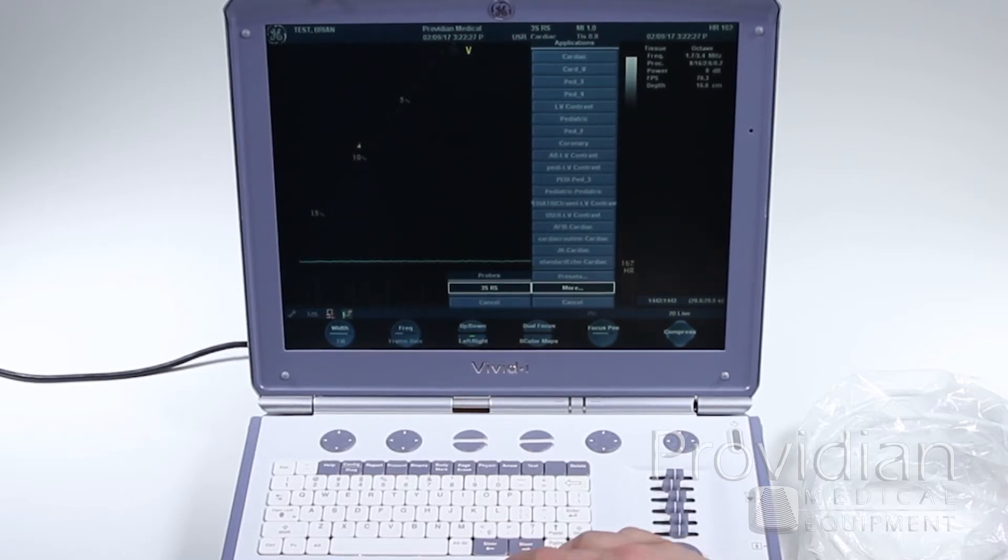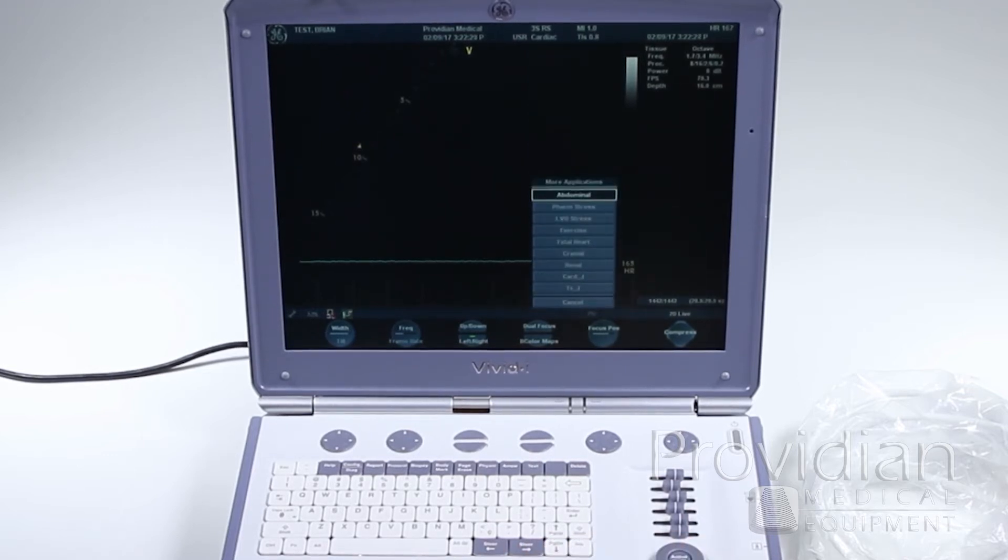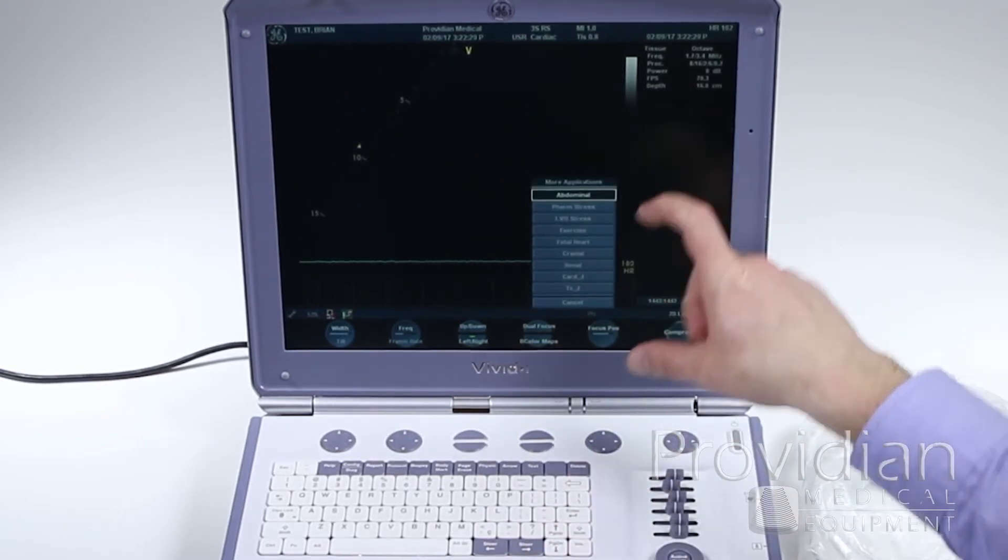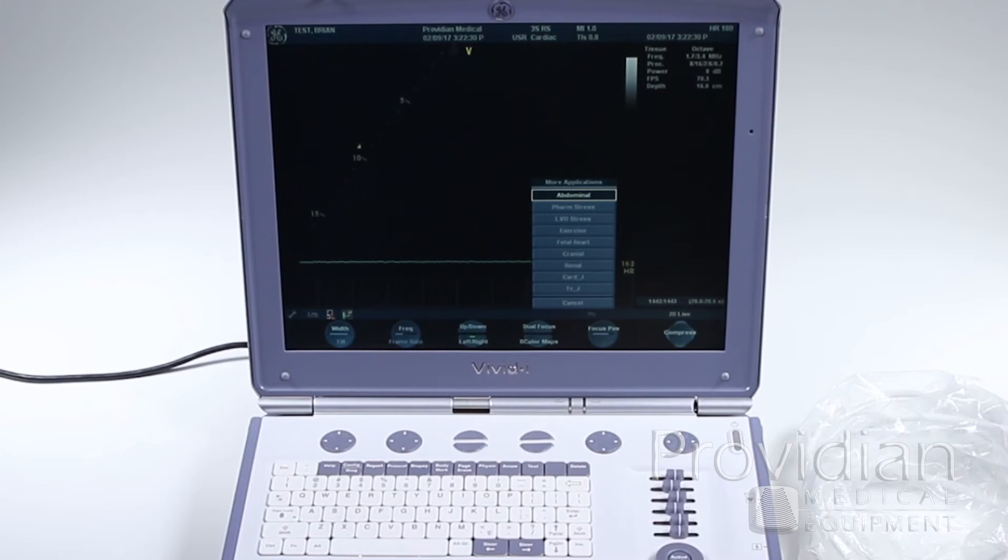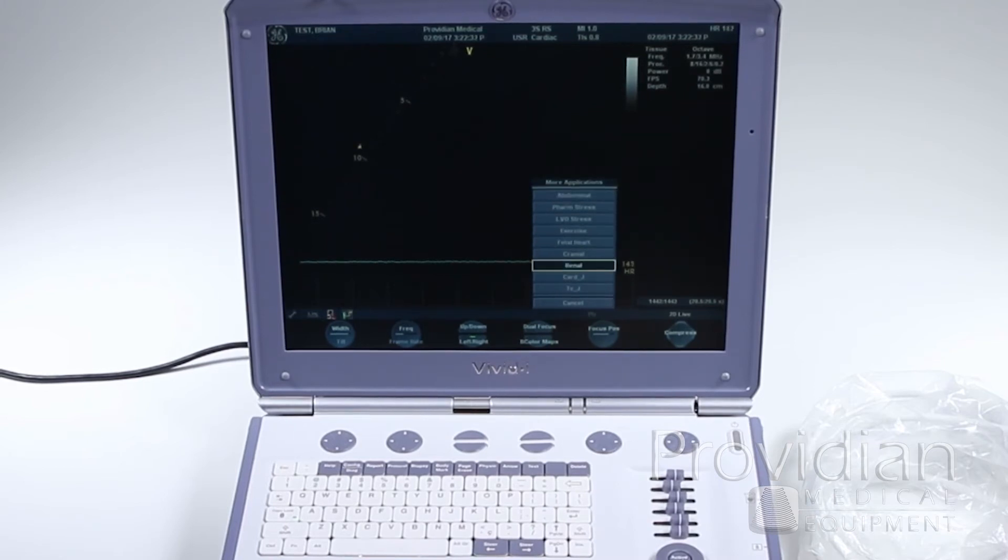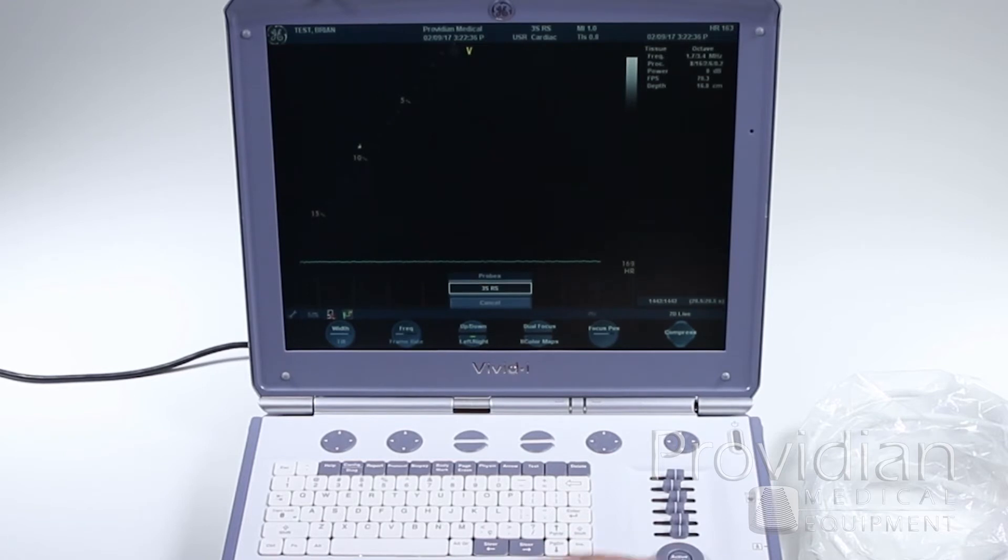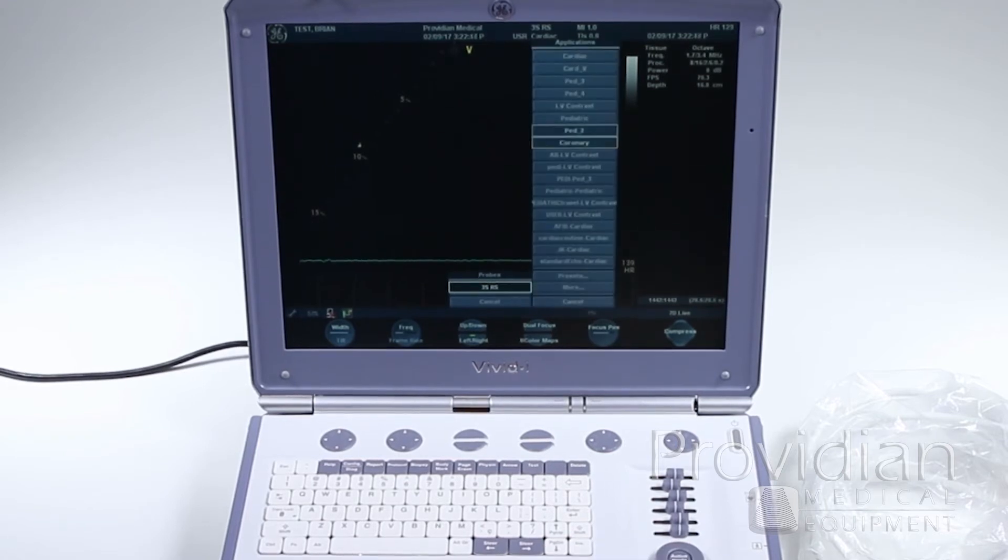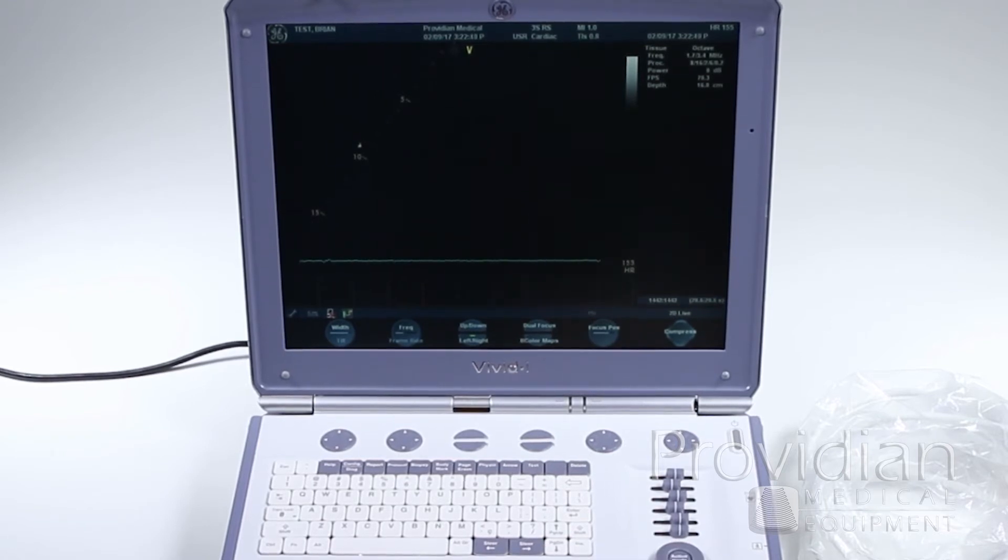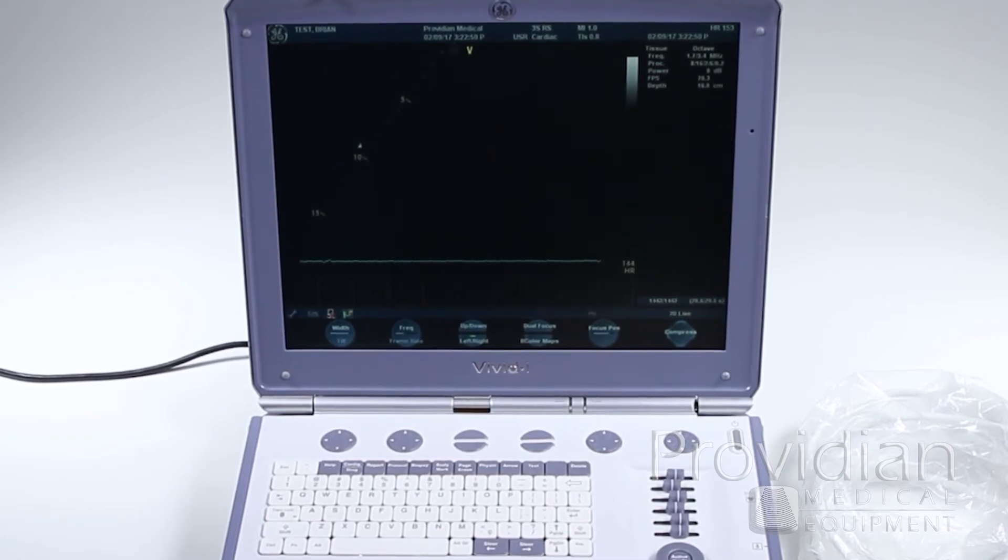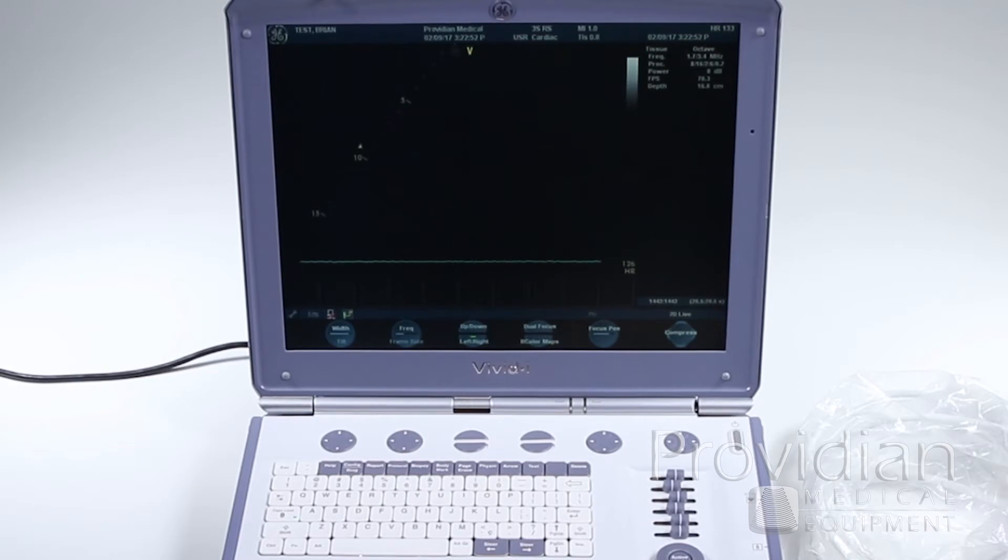But you can also click more, which gives you a whole other set. We have stress, abdominal, fetal heart, etc. So I'm going to hit cancel. I can go to application and then I'm just going to go ahead and select cardiac. It is set as the default application and that's going to be what shows up.